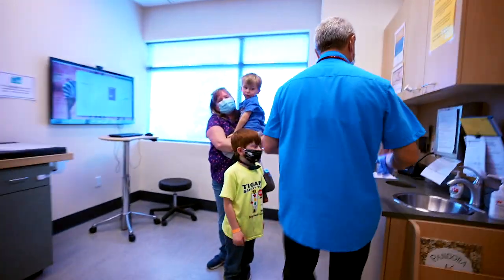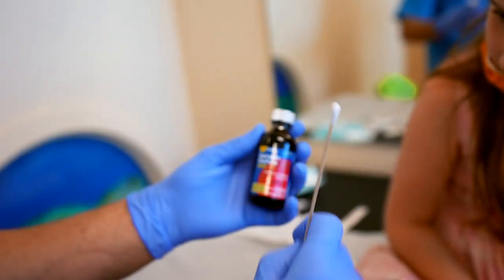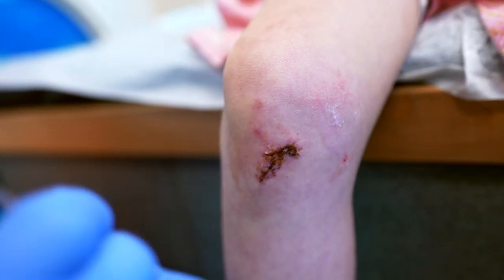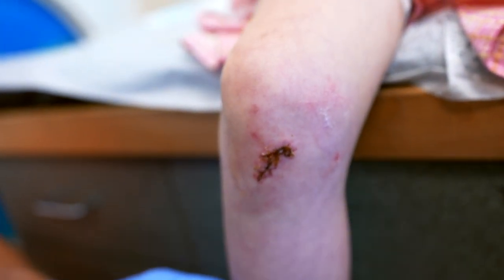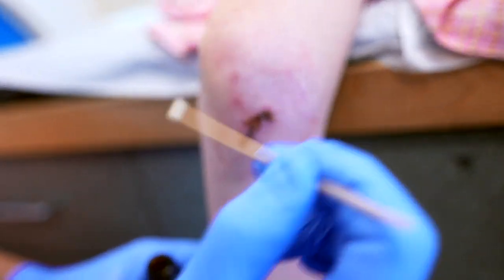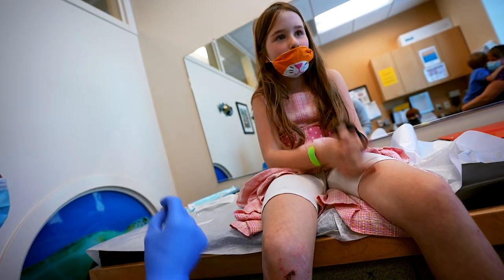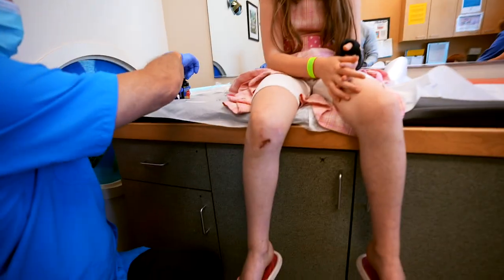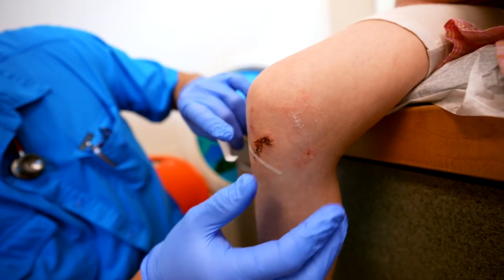I found what I was looking for — well, I didn't find it, my nurse helped me. I was like a lost puppy. These are special band-aids that are going to go across there to help support your knee. Benzoin tincture — this stuff stinks. Is it going to stay forever? Not forever — that's like if you die.